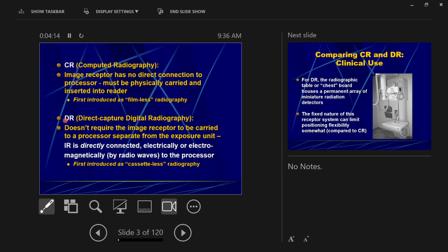Just like on my phone, there's a drive, not a hard drive, but a storage drive. And this picture is now stored on my phone. In very much the same way, when I make an X-ray exposure on this, that image goes directly to the computer's storage. And we can view and display it, just like I can go and take this image on my phone, and let's go back to it. There you all are, bright and shiny people. I can edit this, I can crop it, I can put filters on it, I can flip it around, I can do all kinds of stuff to the image that I produced on this because it's stored digitally, and we can change that information.